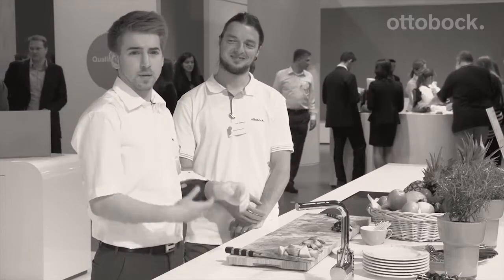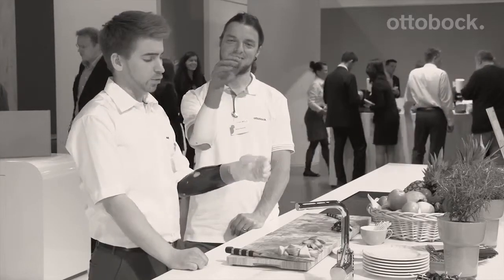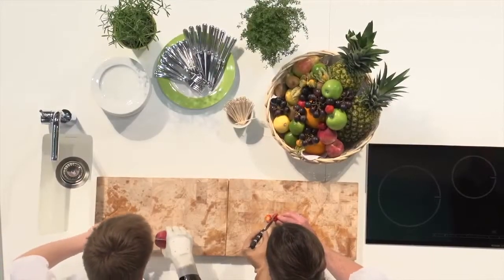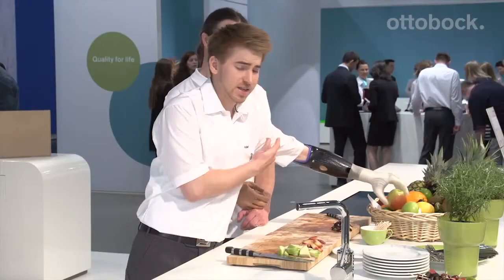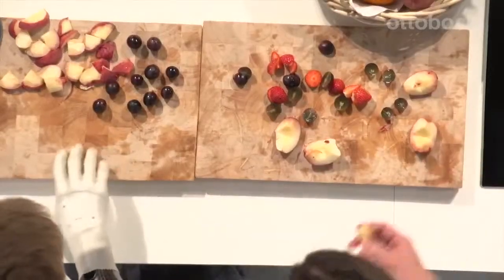What you see here is the Axon Bus prosthetic system. Its big advantage, which we're introducing here, is that you can rotate it to the left or the right. That wasn't possible before. In the past, to grab this apple, for example, required a lot of little shoulder and elbow movements — it wasted time and could lead to malpositions.